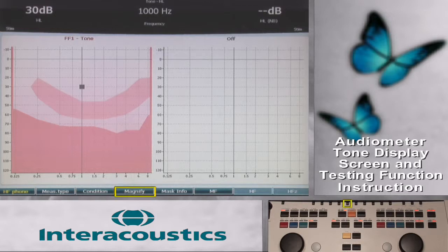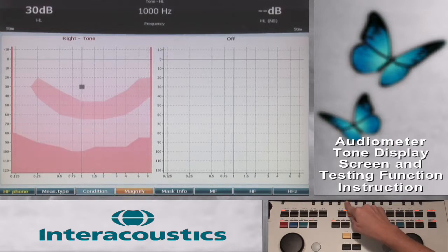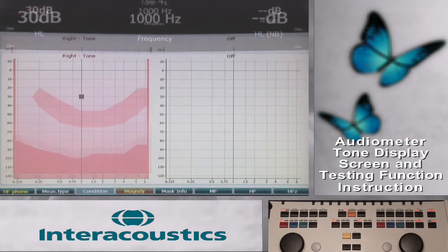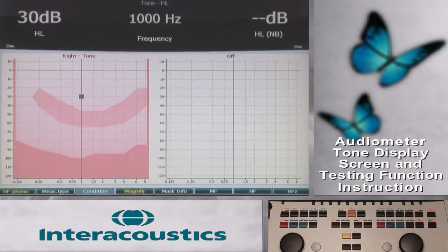The Magnify function key will increase the size of the top bar to display the frequency and decibel level of channel 1 and channel 2.